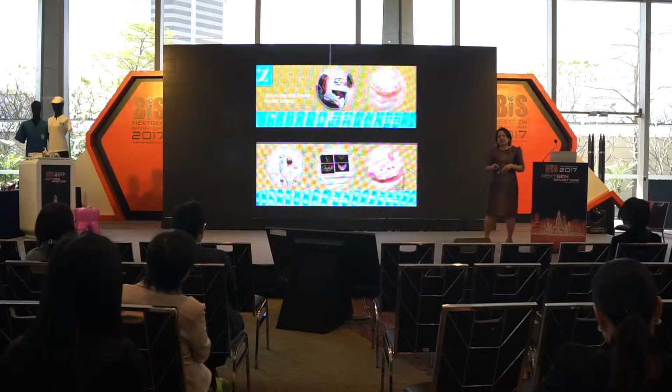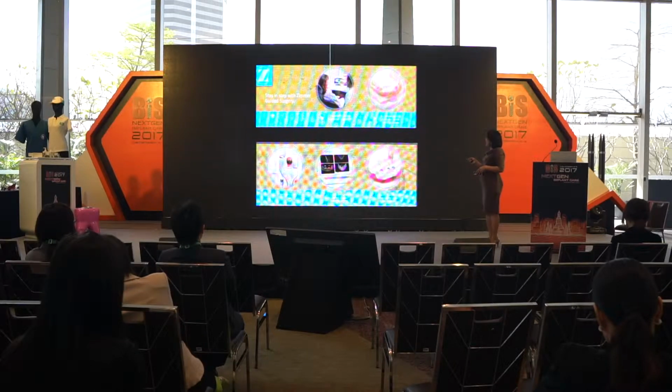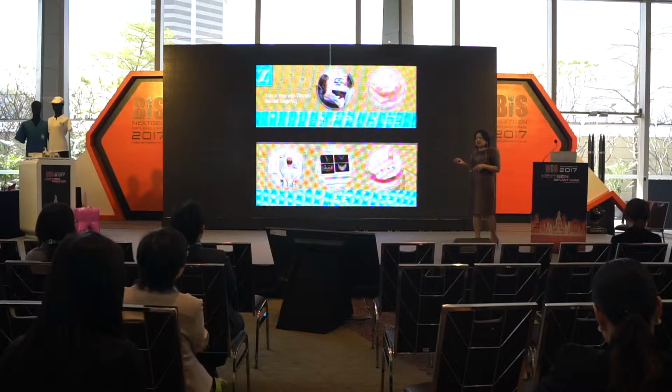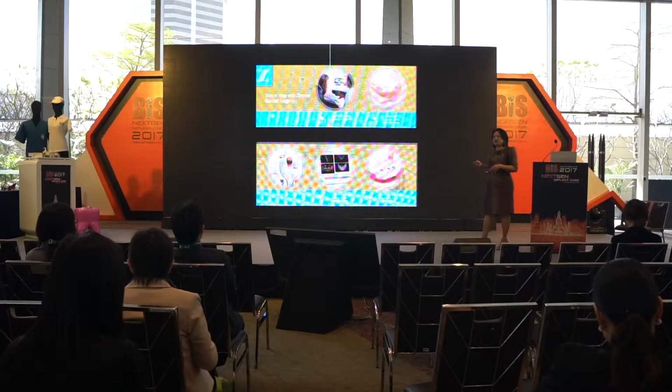How can you start with this? For the Zimmer guided surgery, the first step is you discuss with the patient as much as you can, and then you make the surface scan or the restorative scan. You can even make the final restoration and scan, like a pre-preparation scan.